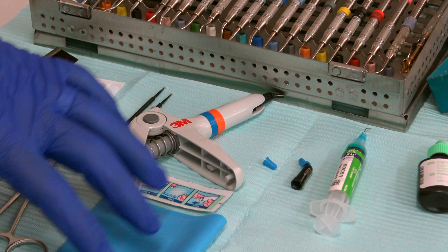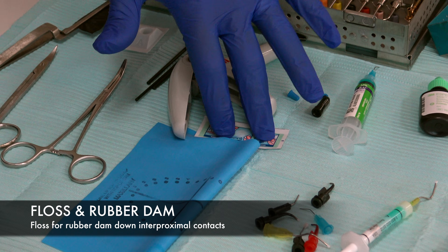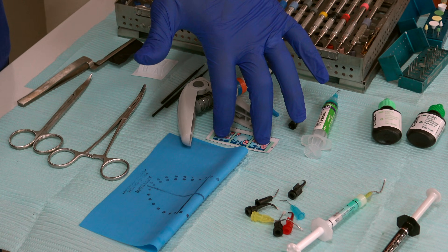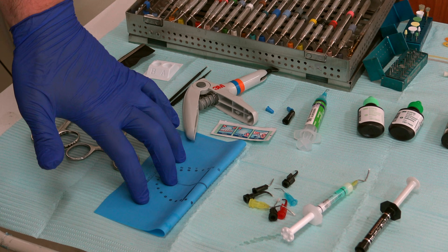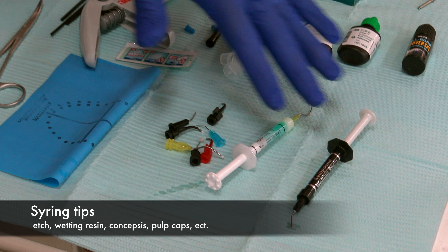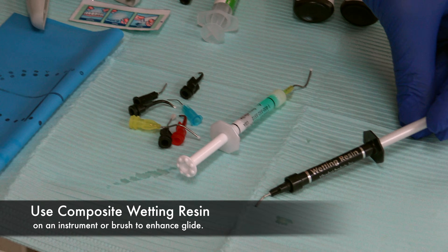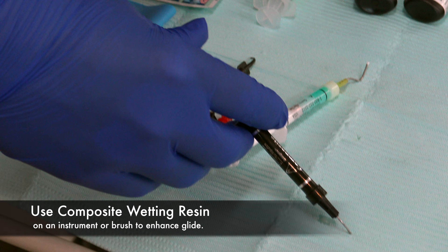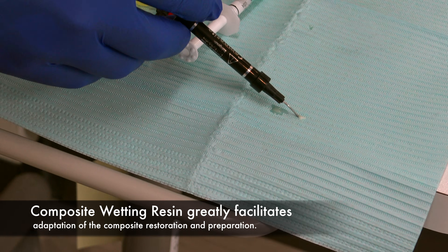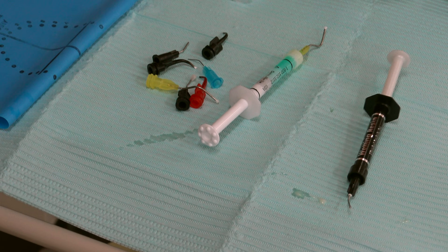We have floss and rubber dam. Floss is for threading our rubber dam down and can also be used for checking class 2 interproximal contacts. Here's our rubber dam, and our tips that can be used on different syringes that extrude different materials. This is a wetting resin — a little white flowable piece of resin that takes the stickiness off your composite so you can move it around better with your brushes or burnishers.